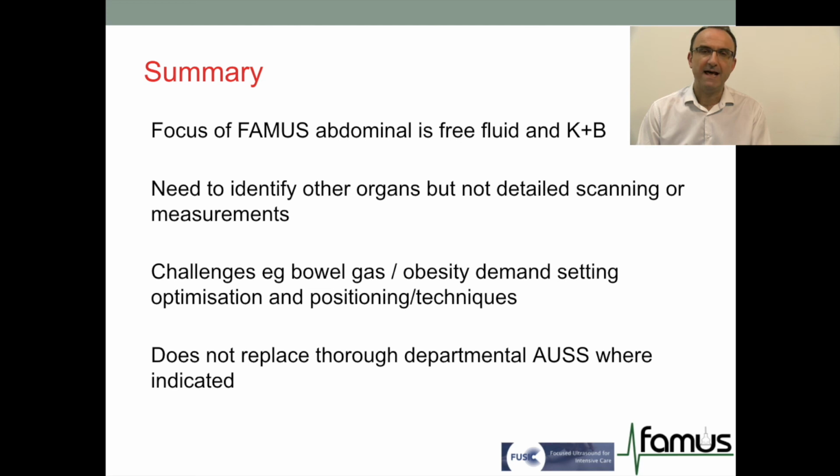And last but not least in terms of importance is to, once we have done our study and we have picked up anomalies, request the opinion of an expert just to confirm our findings.